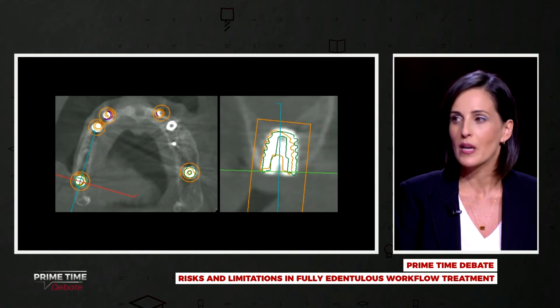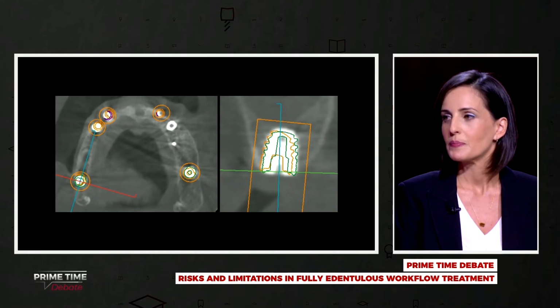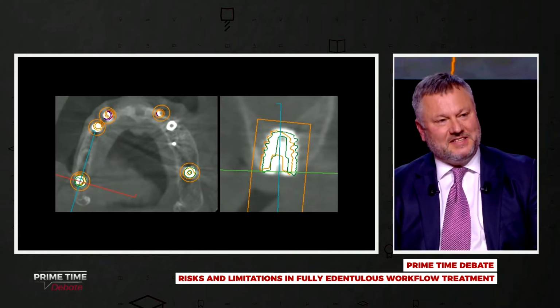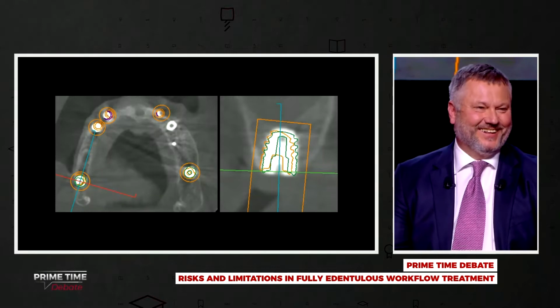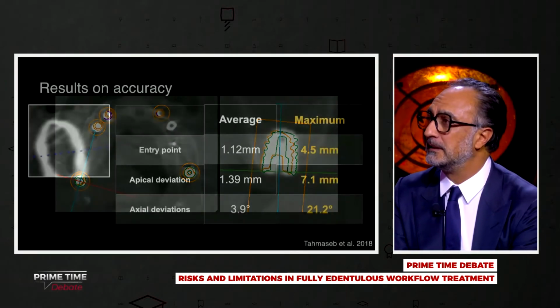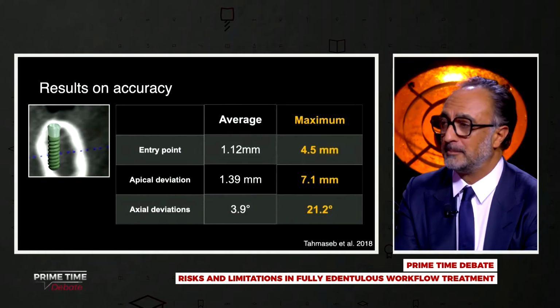However, it's not 100% fitting. So I suppose, Ali, you want to comment on this with your mini implants? No, I just want to say it's true because if you look at the literature, there are a lot of publications, papers talking about inaccuracy.